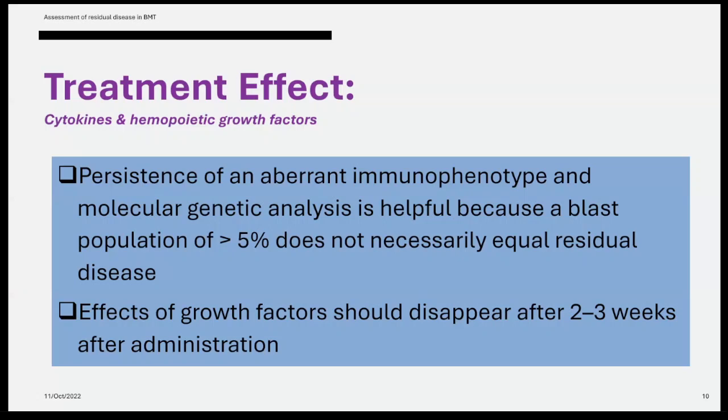Okay, you cover yourself, you sort of protect yourself by that statement, rather than come up with the final verdict without having some comment, yeah. And then, or else, you may also add an additional comment that please monitor these features. In growth factor related changes, all those blasts will disappear 2 to 3 weeks after the last administration.